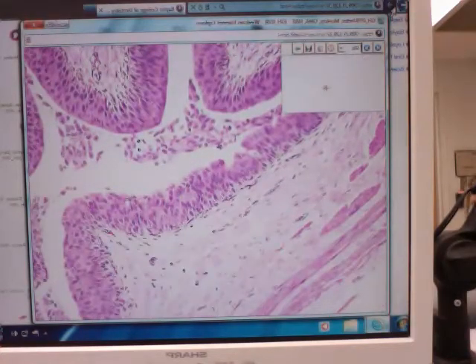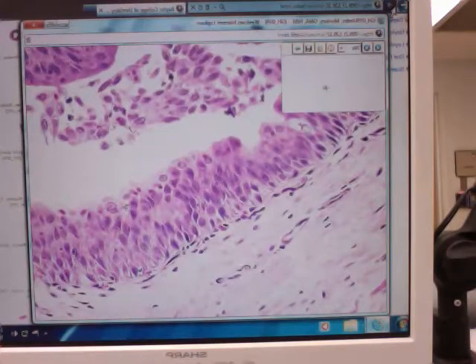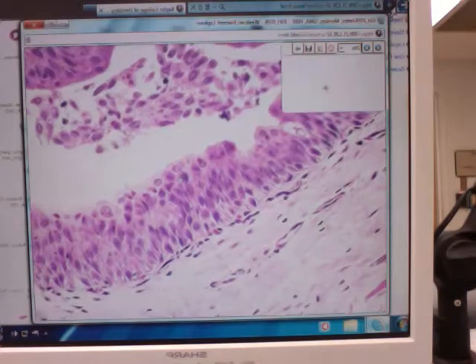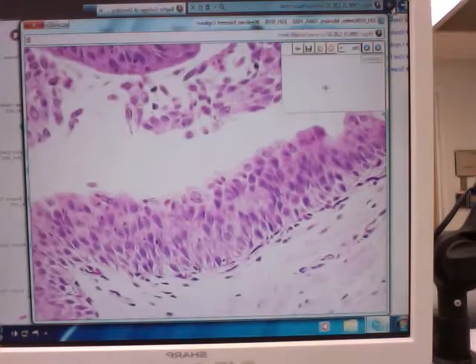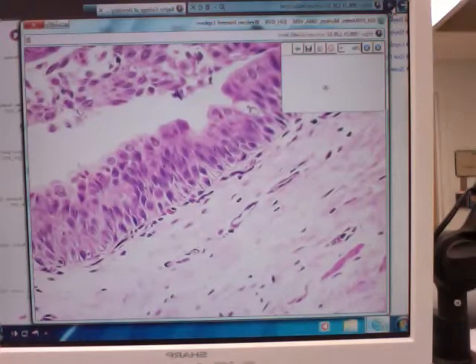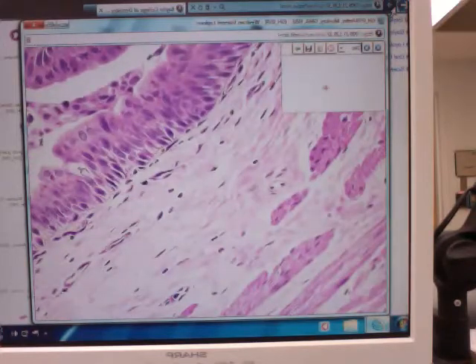Okay, this organ is also another example of where you would see transitional epithelium. Again, when you look at the outer surface, you see this kind of dome-shaped, irregularly shaped epithelium. So you just need to get the feel for how it looks in, say, bladder versus ureter here. Don't worry about the organ, but you know it's a stratified tissue. You look at the shape of the outermost layer of cells, irregularly kind of dome or puffy-shaped cells. This again, transitional epithelium. Then when you look directly beneath that, all this tissue right in here, here's lots of cells packed amongst some pink collagen fibers. Again, loose connective tissue versus whenever you get over here in like an area like this.